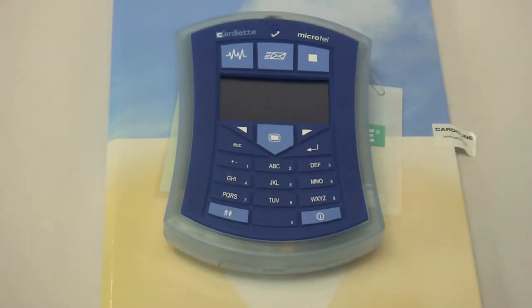Cardioline U.S. is pleased to introduce the Cardioline Microtel. This is a handheld 12-lead EKG system that uses Bluetooth communication to pass data back and forth to a PC.